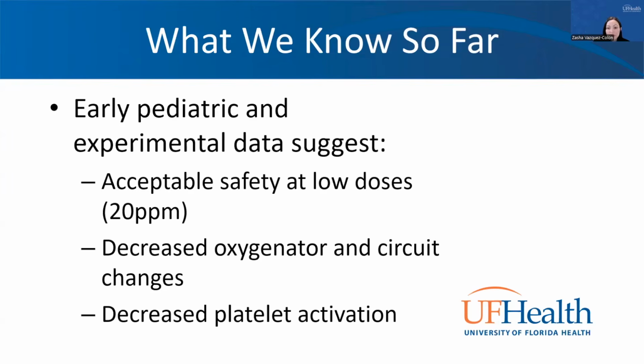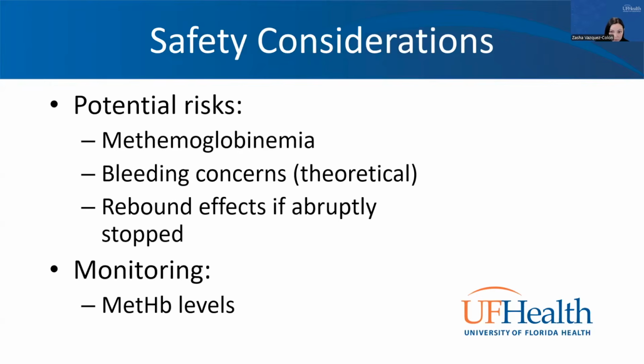Now, what do we know so far of the use of nitric oxide in the circuit in patients on ECMO? There are pediatric studies and experimental studies that suggest that nitric oxide is acceptable and safe to use at low doses. It has also been shown to decrease oxygenator and circuit changes and to decrease platelet activation. And we will go over some of those studies shortly.